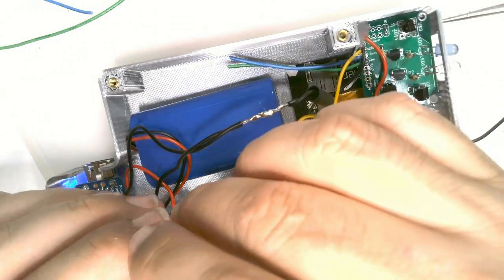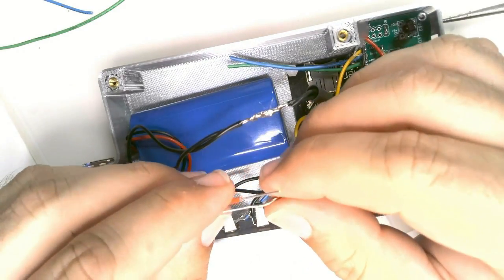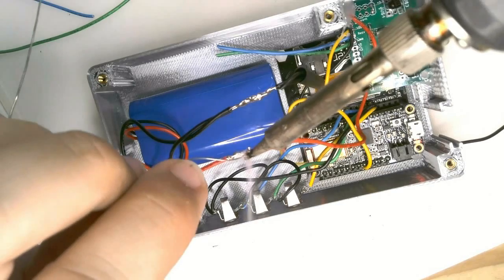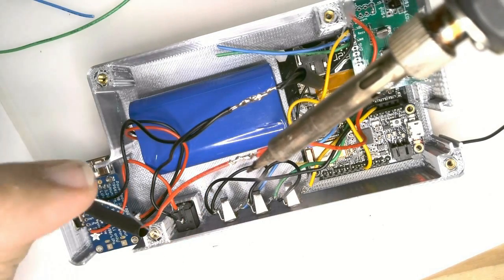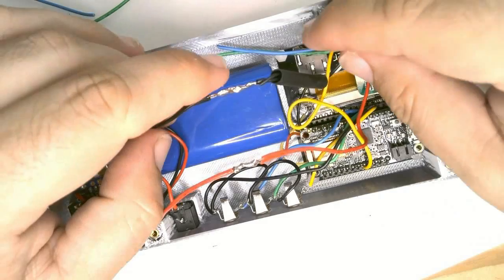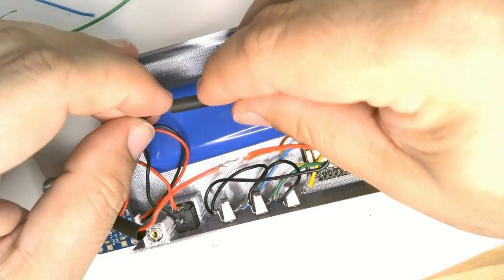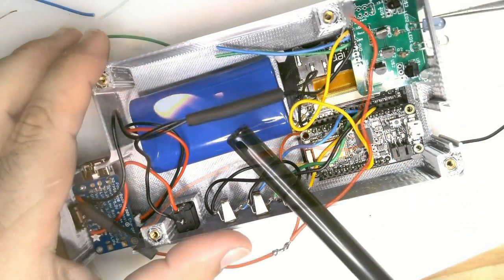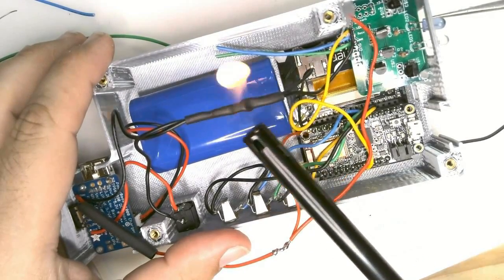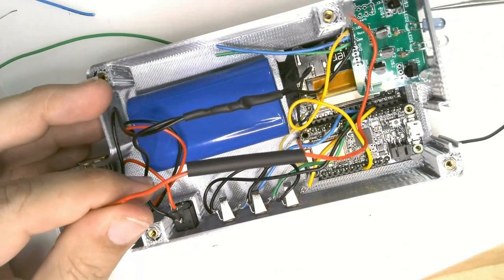and do the same with the red wires. There's 1 red power wire on the left and 2 red ones on the right. Twist them together and solder them securely. Slide the heat shrink tubing over the joint and shrink it using a heat gun or a lighter. Do the same for the power wires. Slide the tubing over and heat it to shrink it.